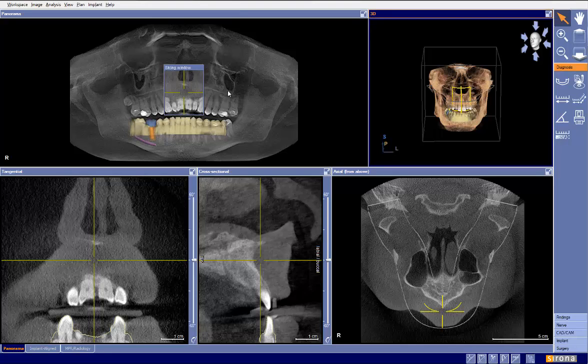We have a case here for implant placement in site number 30. The tooth has been removed — I do not know how long it has been gone for — but it's a healed site, so we don't have any worry about stability or immediate placement issues.